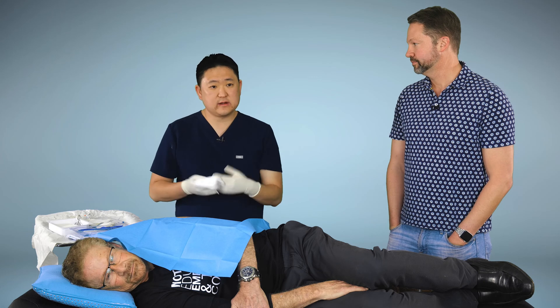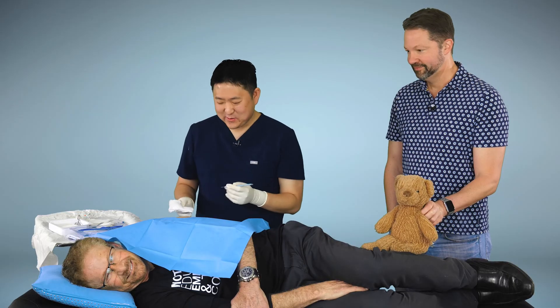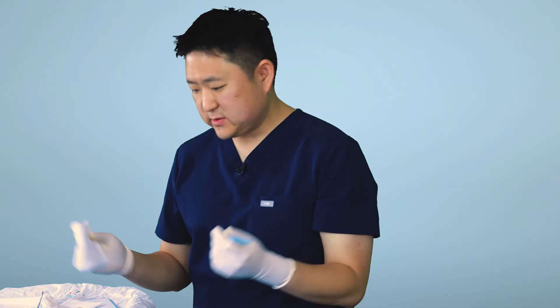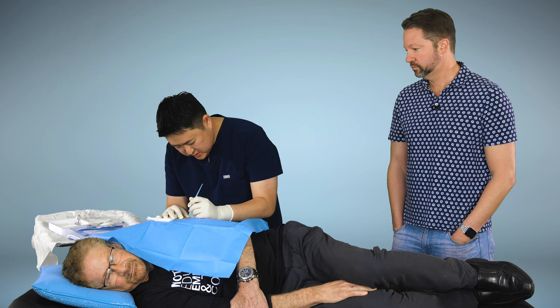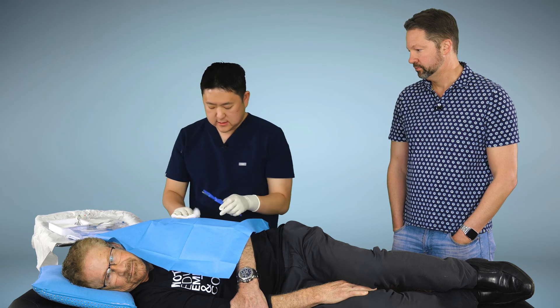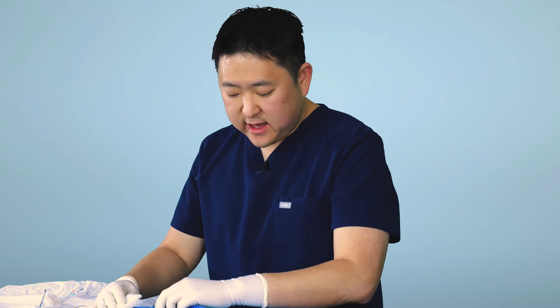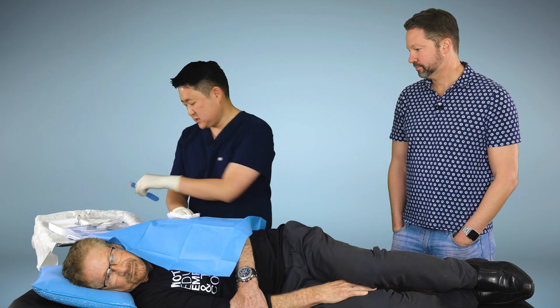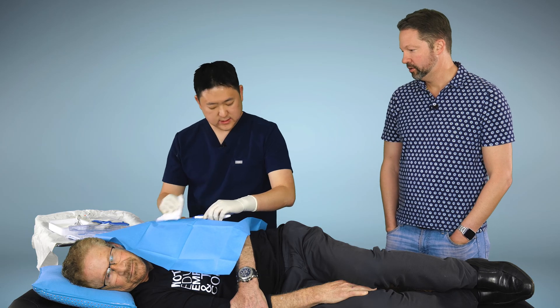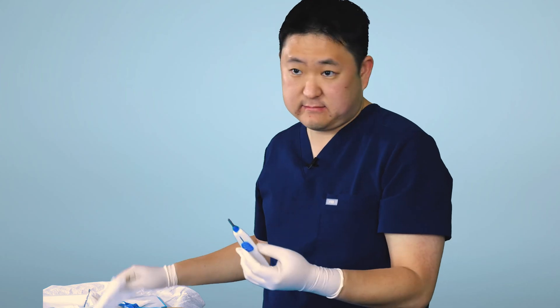You don't need any fancy equipment — just a table and supplies, and Mr. Fuzzleworth. We'll do a quick test of sensation just to make sure the numbing medication is fully working. Does that feel prickly at all or just pressure? Just pressure. So we know the numbing medication is working. First I'm going to make a tiny incision, and then this tool helps us create a little pocket where the sensor is going to go. It was just that one little incision — less than half the width of my fingernail. A very narrow incision, and now the tunnel has been created.